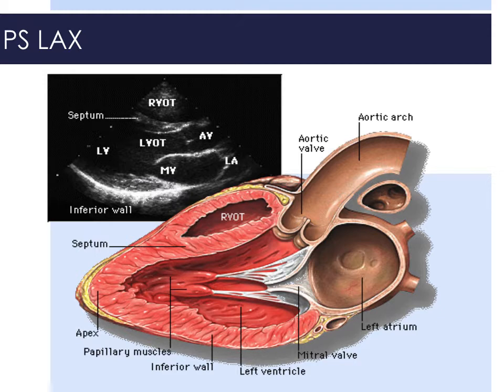And then underneath we see the aortic valve and the aortic root. Underneath, below the aortic valve, we can see the left atrium, with the three structures almost aligned and almost with the same diameter.